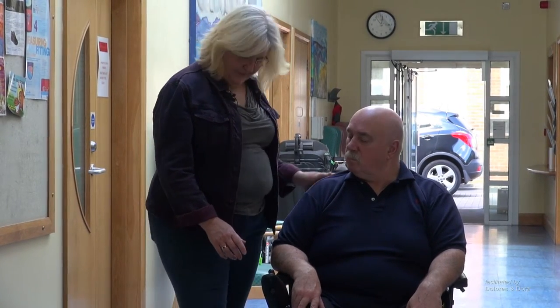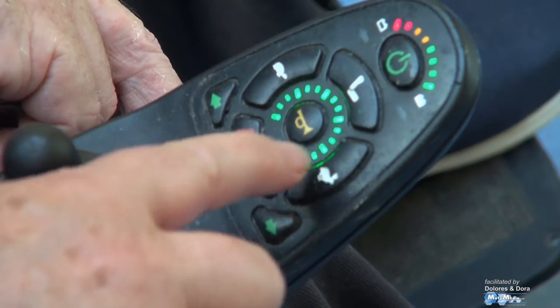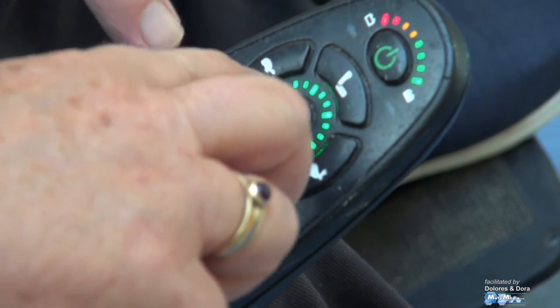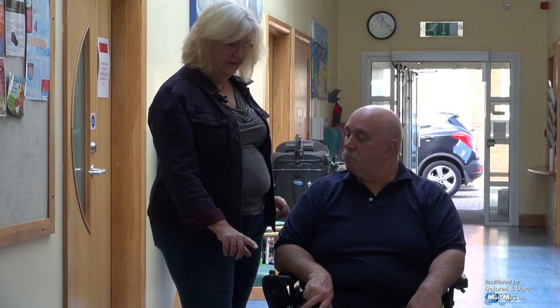Hello David, we're starting the wheelchair training today. Thanks for coming in. The first thing you need to know is to switch the wheelchair on — this button is to turn the wheelchair on. When all of the lights are lit up, you're at top speed. You're indoors, so you need to take it back with the tortoise to half speed or just under, because for indoors you need to be at two miles an hour.